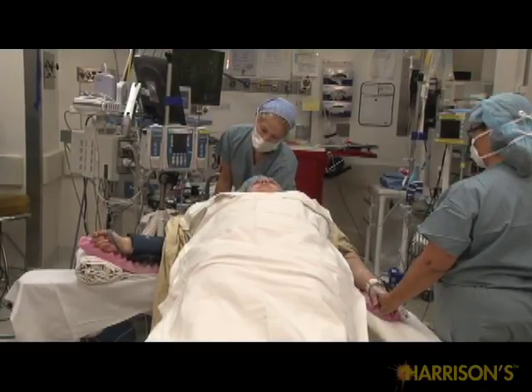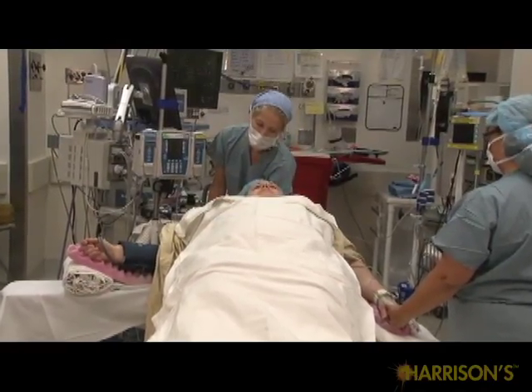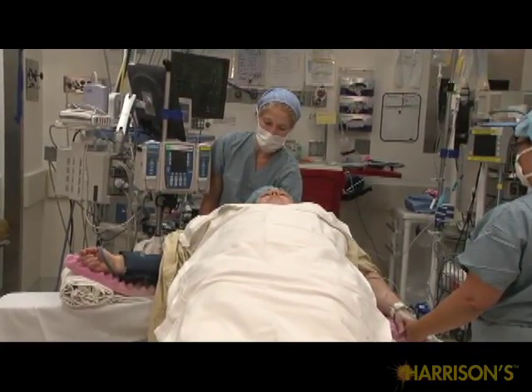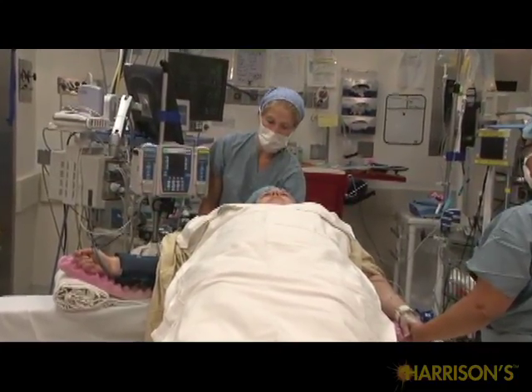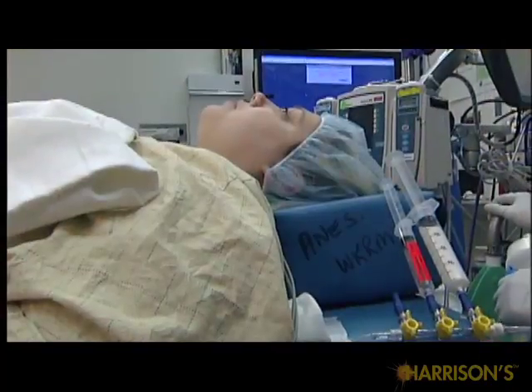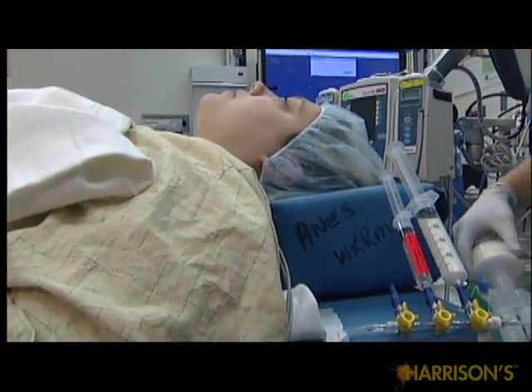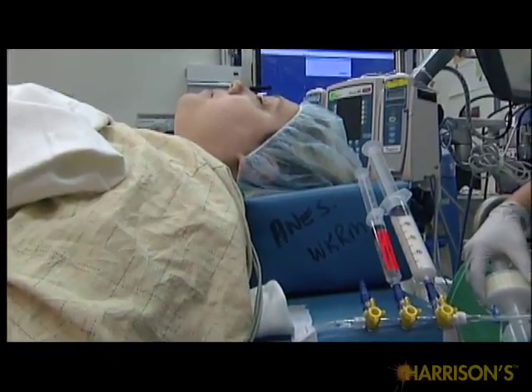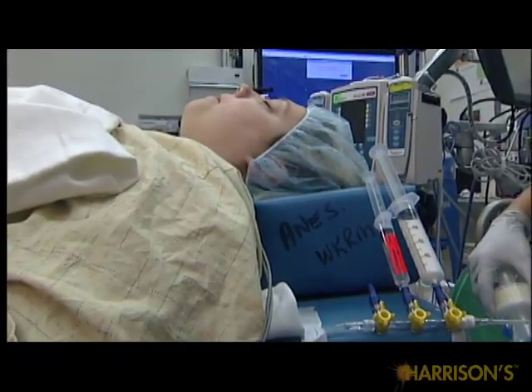Proper positioning of the patient is critical to successful intubation. The patient's bed should be adjusted so the height of the patient's airway is at the level of the provider's xiphoid cartilage. Place the patient in the sniff position to help create a line of sight from the eye of the provider to the larynx so that the oral opening and the pharyngeal axis overlaps.